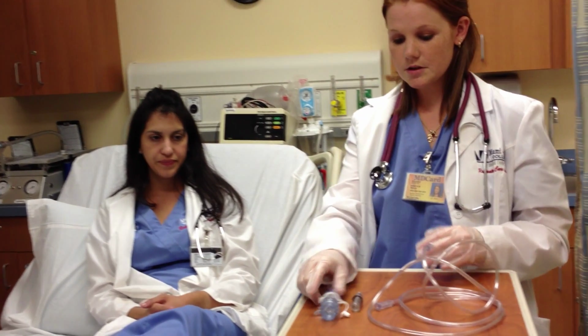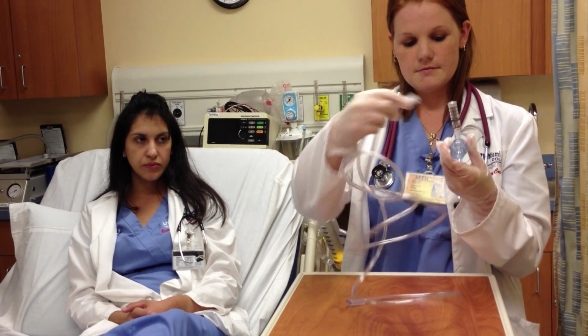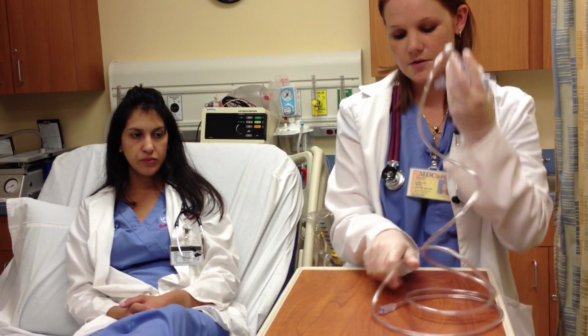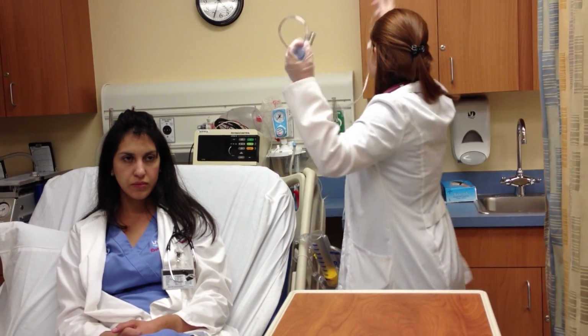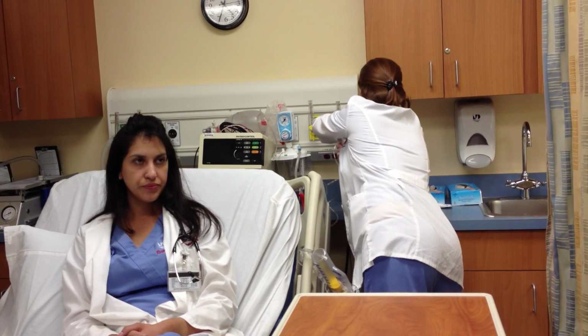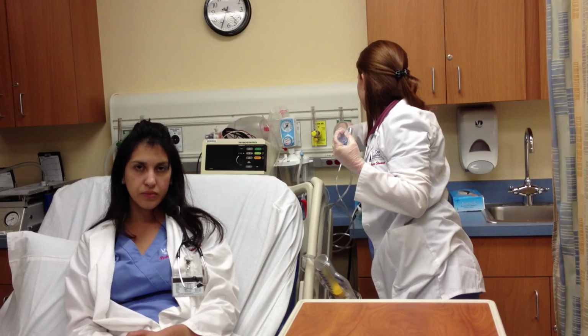Now, I'm going to gather my equipment and place it together. Manometer goes on top. Oxygen tubing. I'm going to connect it to the flow meter. Make sure your flow meter does not exceed 50 to 60 psi. You want to start it off at 5 liters per minute.